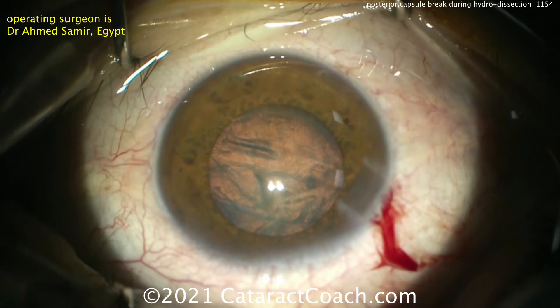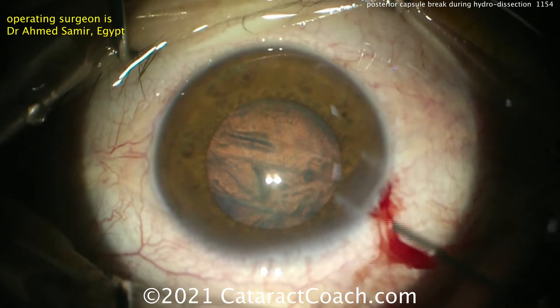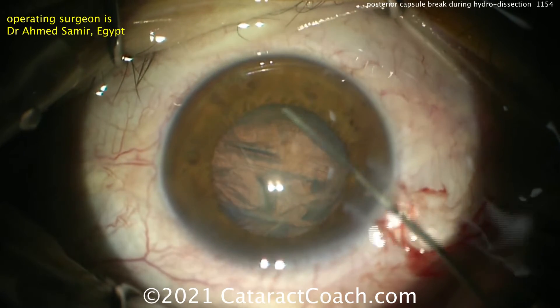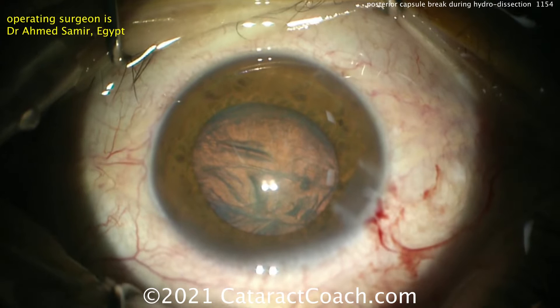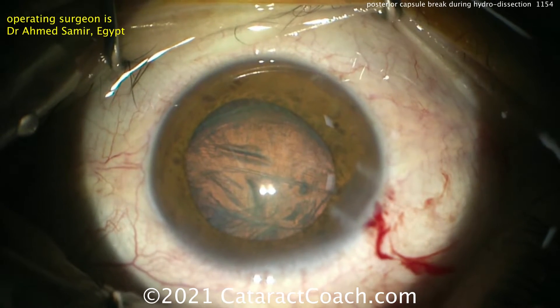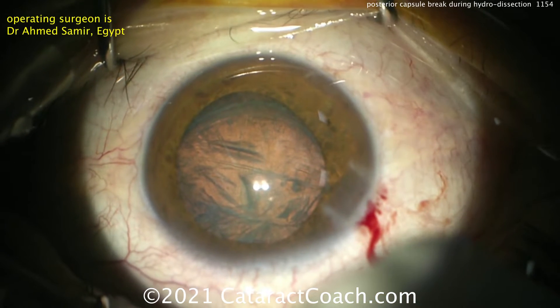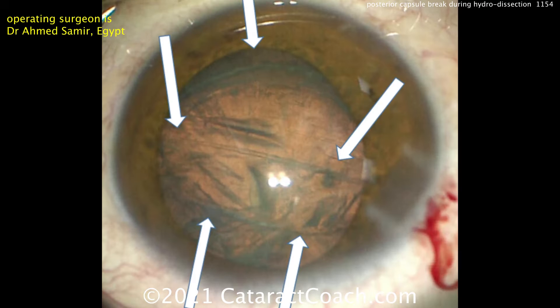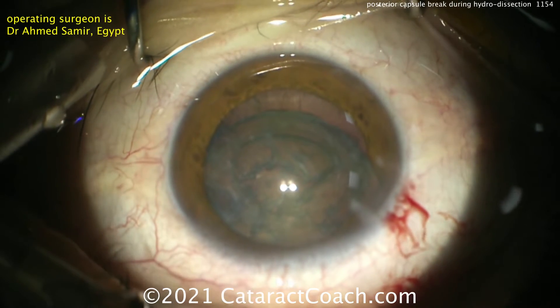So what do you do in a case like this? You need to get the lens nucleus up out of the capsule bag. You want to prevent it from going south or going into the vitreous cavity. He's putting in more viscoelastic here, but that posterior capsule's already split down the middle. To avoid this, use less pressure during hydrodissection and make sure you have a sufficiently large capsulorexis. After one fluid wave, let some of that fluid out by tapping the center of the nucleus.